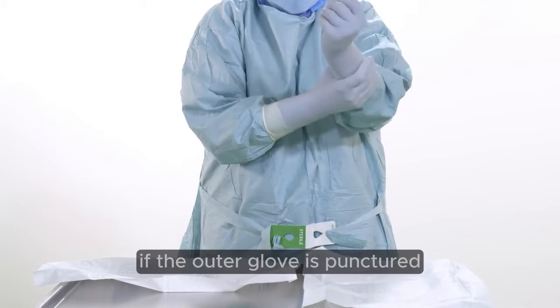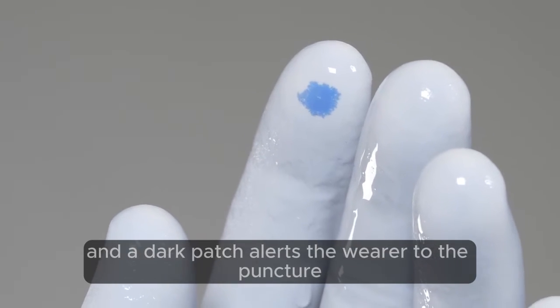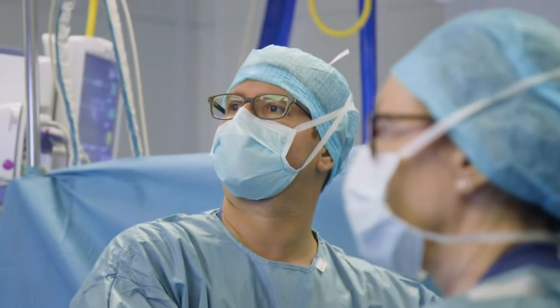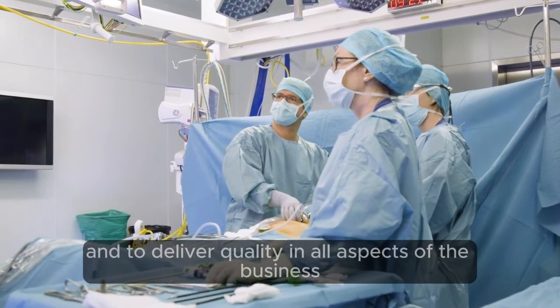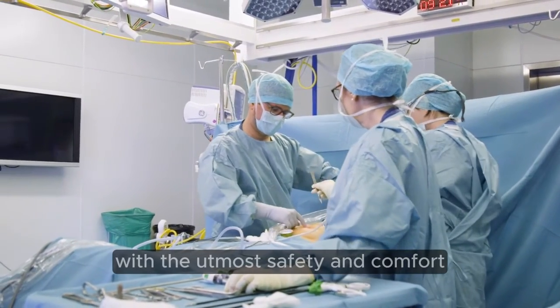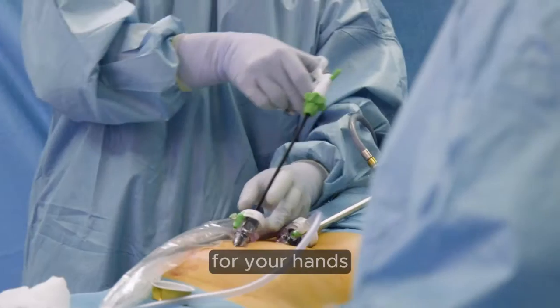If the outer glove is punctured, fluid flows between the two gloves, and a dark patch alerts the wearer to the puncture. We're committed to improve, to innovate and to deliver quality in all aspects of the business, and above all, provide you and your patients with the utmost safety and comfort. And that means working to bring you the best possible protection for your hands.